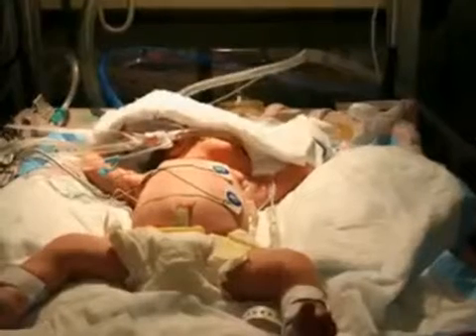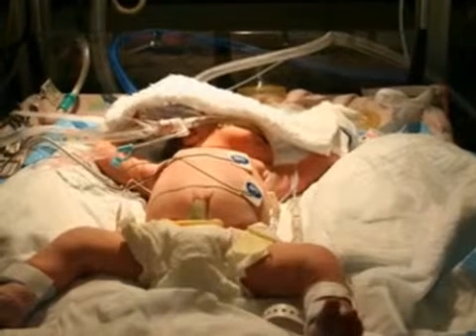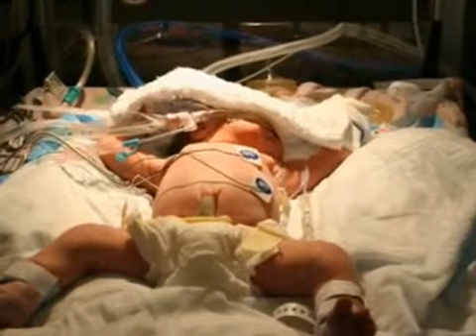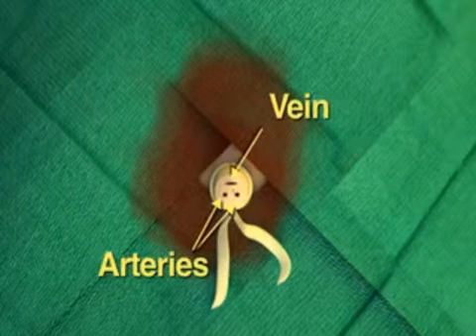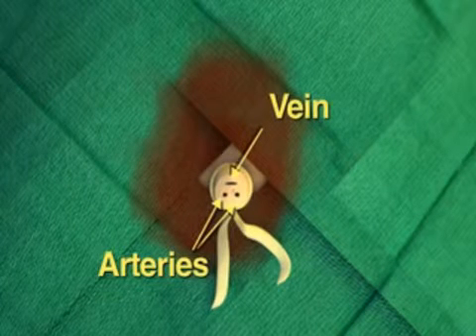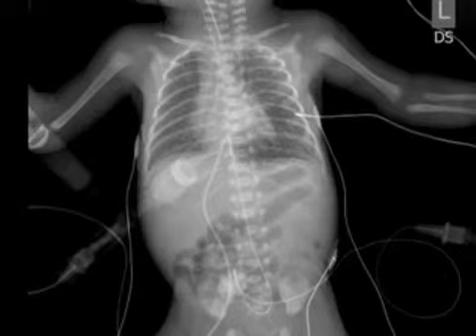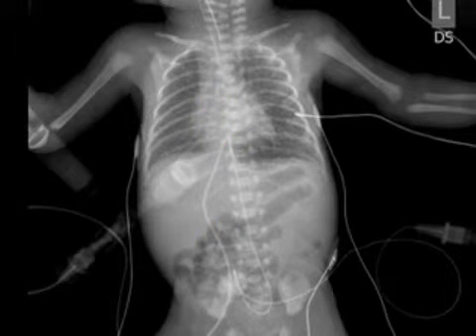After the procedure has been explained and consent obtained from the parent or parents, review the records and examine the patient to confirm that there are no contraindications to catheterization. In your examination, concentrate on the anatomic landmarks. You must then decide how deeply to place each line. The umbilical artery catheter, or UAC, can be placed in a high-lying position between thoracic vertebra number 6 and 9, or in a low-lying position below the third lumbar vertebral body. Here, we will describe the procedure for the placement of each type of catheter.